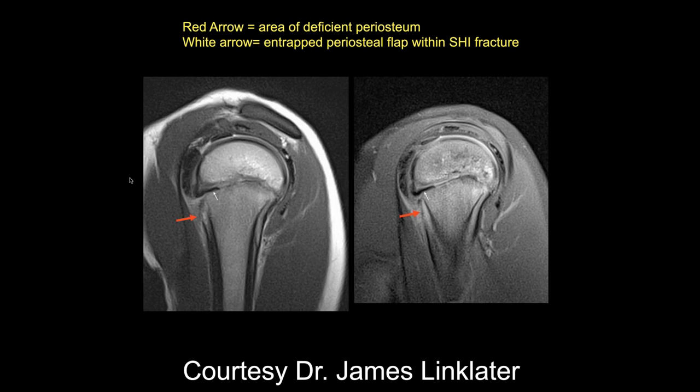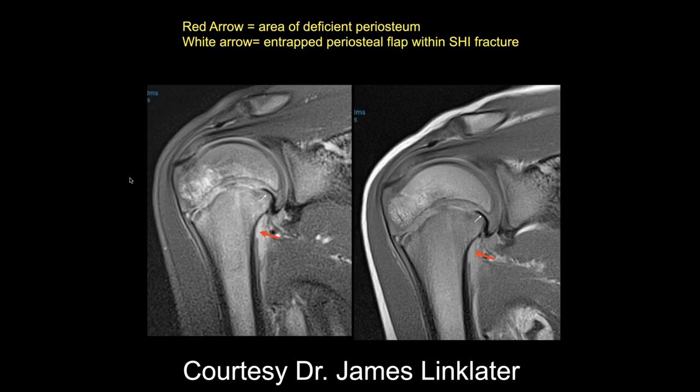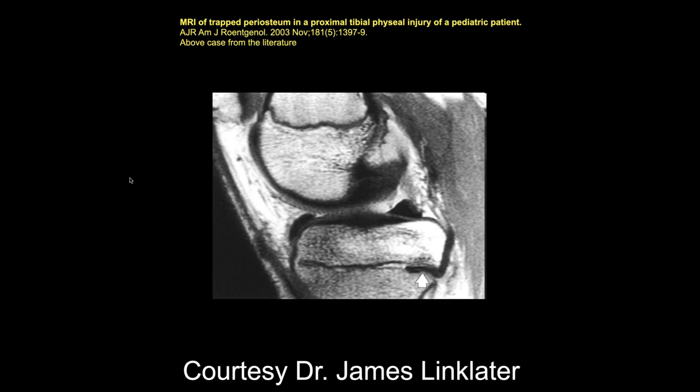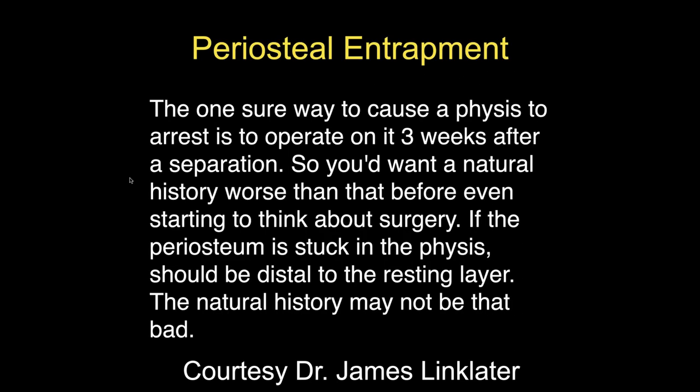Another case: a nine-year-old gymnast, fall from bars. It looks like a Salter-Harris type fracture — an epiphyseal fracture with periosteal stripping — and the periosteum flaps into the growth plate, so it's trapped periosteum. Here's a similar case in the tibia from James Linklater in Denver — a little bit like what we talked about before.